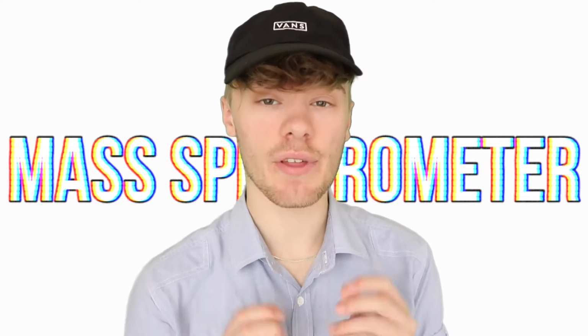We are going to go through one of the most crucial, vital instruments in modern forensic toxicology. This is that of the mass spectrometer. A mass spectrometer is an instrument with a relatively simple concept. It is able to ionize a sample and measure the resulting mass to charge ratio, with the ability to then distinguish between chemical components and elements.